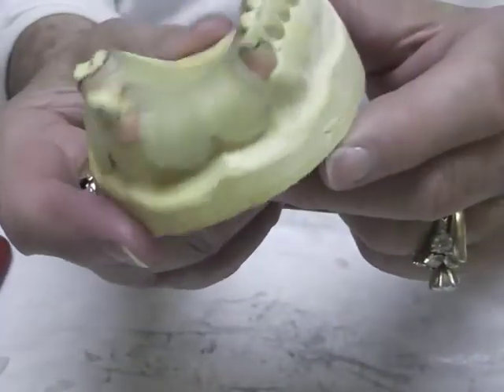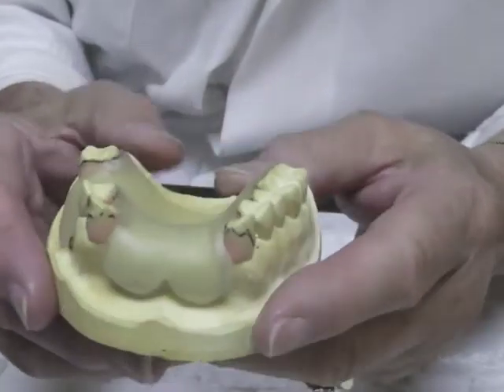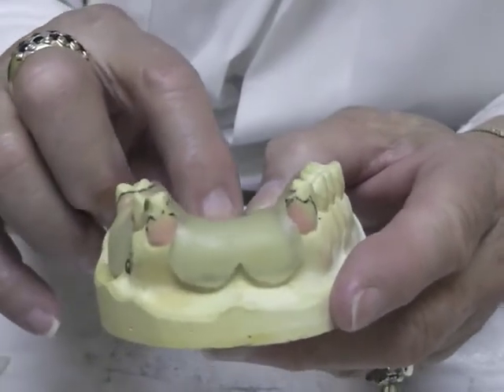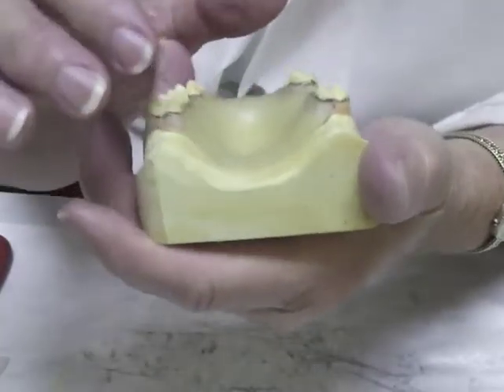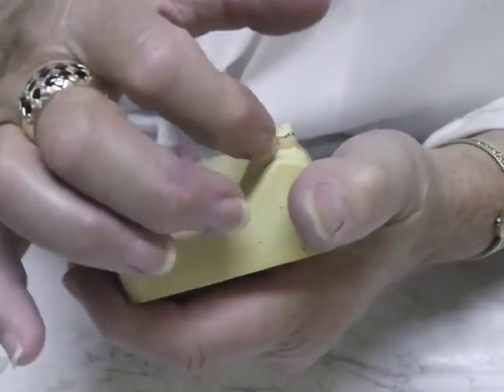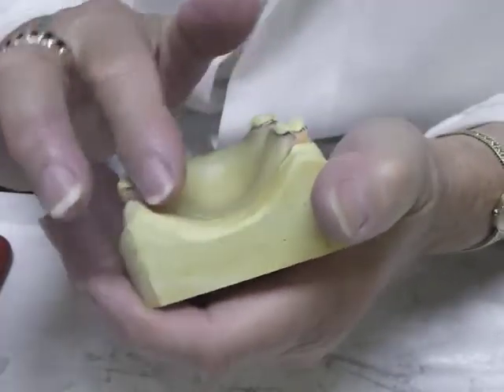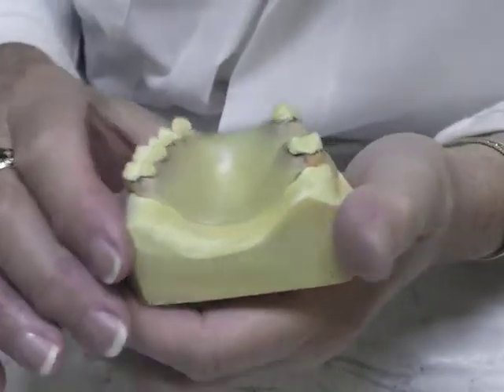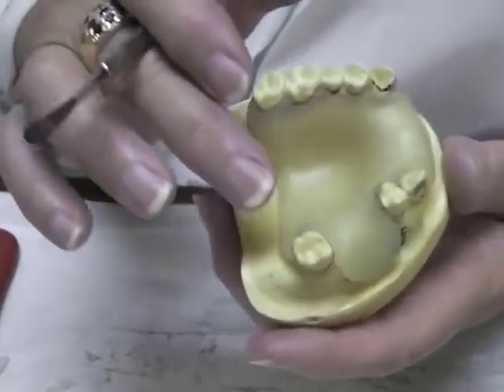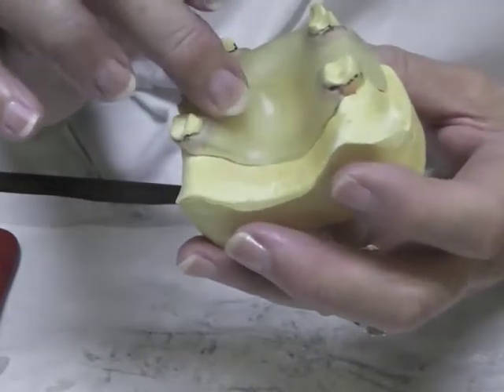Alright, we're ready to cure this one. We're going to stick it into the triad machine for about 20 seconds and then check this area in the back, because this area has a tendency to pull away from the palate. If you cure it for 20 seconds and then re-adapt it, you'll work out some of that warpage. I want it placed above the survey line so that it is in fact adapted to the tooth.